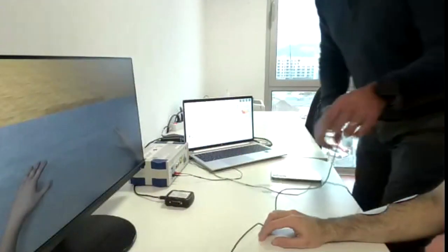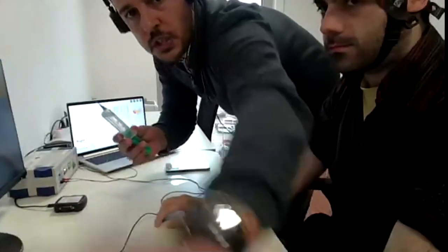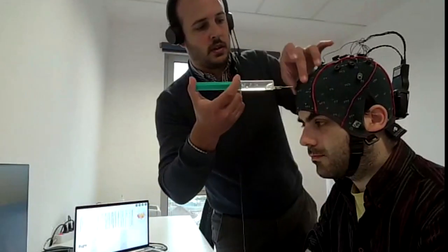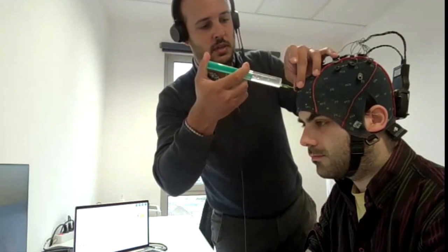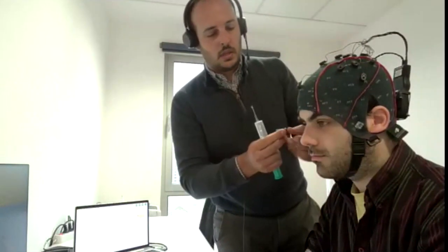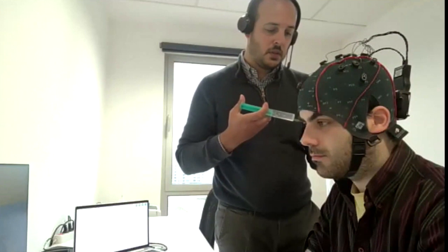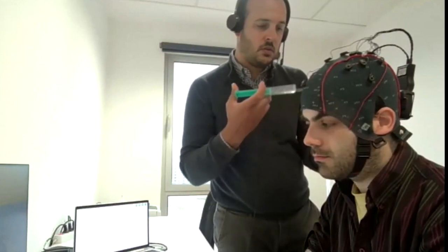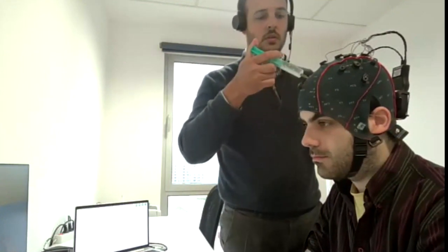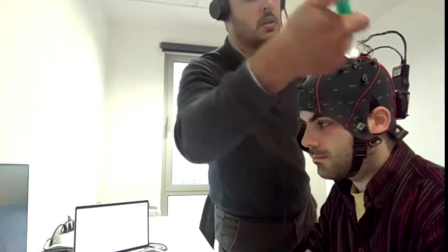So, okay. We have to gel the EEG cap now. For gelling it, we always start with the yellow electrode we have in the front, the ground. And also we have an earlobe electrode that should be placed in the ear. We put also a bit of gel here. And then we always start in the same order, filling each electrode with a bit of gel, right?